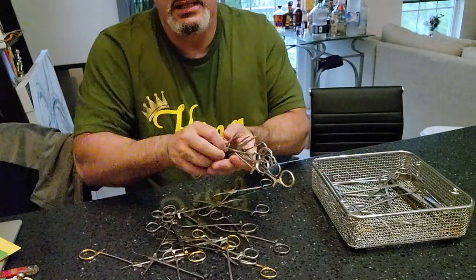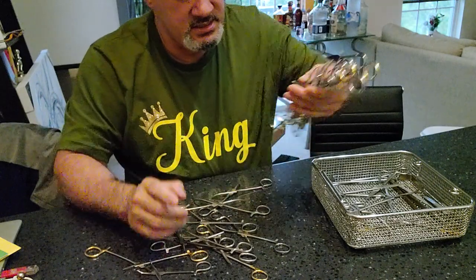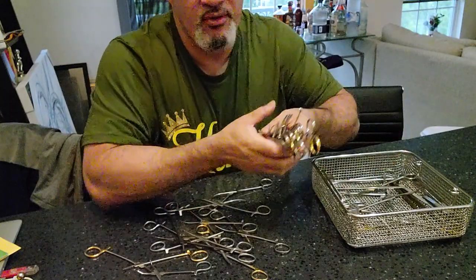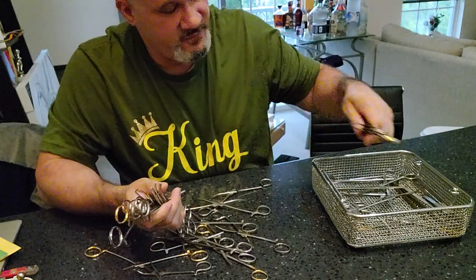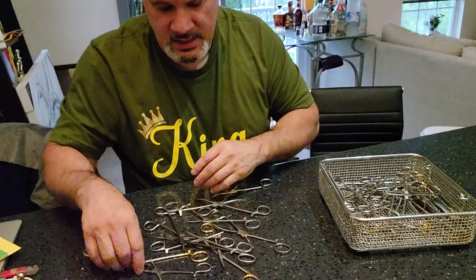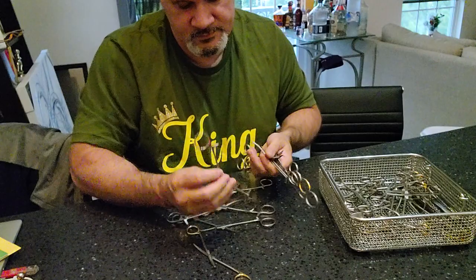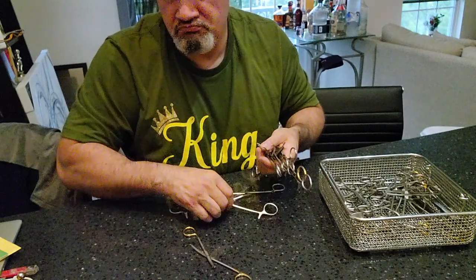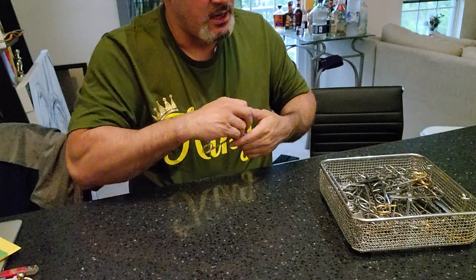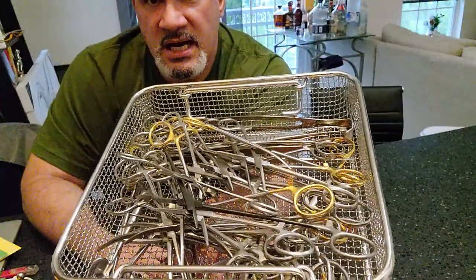The best practice is to butterfly your instruments and have them standing straight up. The standard practice is that instruments are butterflied and laid flat in the basket. Is that an acceptable standard? Yes, it is. Is it the best practice? No, it's not. Not every facility can follow best practice, so is it acceptable to send through the washer? Yes, it is.